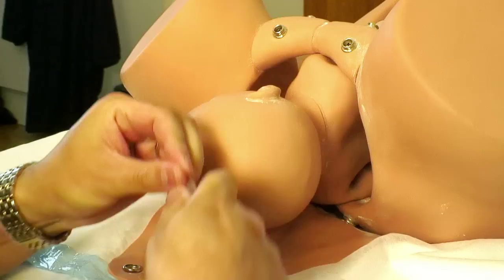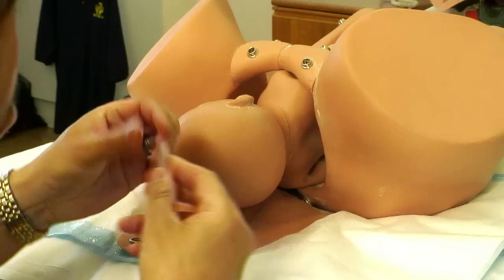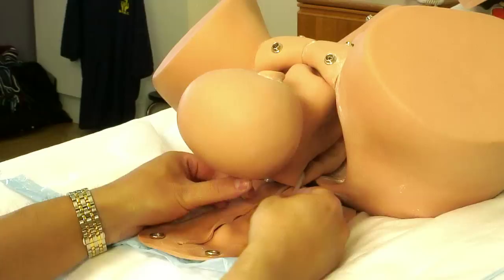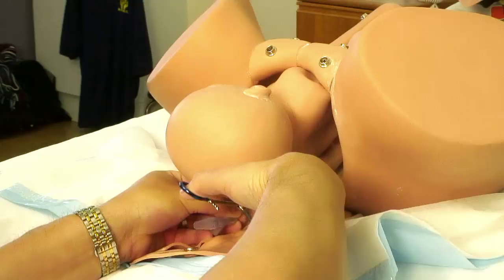I'll now demonstrate the technique with my own commentary. The baby's shoulders are stuck and we've tried the abdominal manoeuvres, so we're now going to apply the posterior sling. Looping a piece of infant feeding tube or nasogastric tube, we push the loop posteriorly to anteriorly in the baby's axilla, and then using the left hand we pick up that loop and pull it through. We now have a double loop that we can apply traction on, using either our fingers or by applying a clamp.